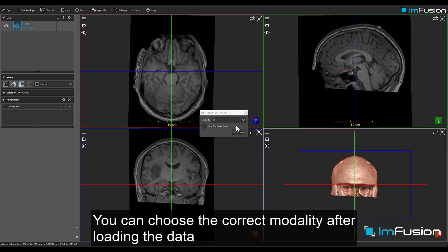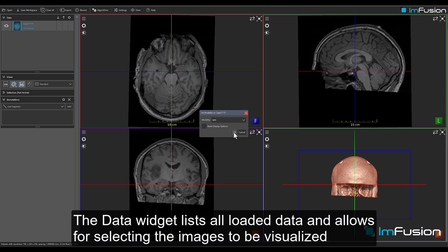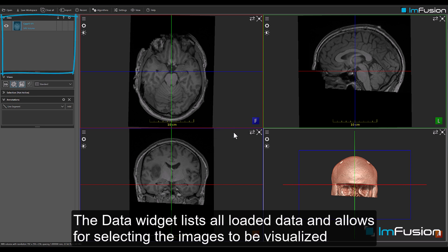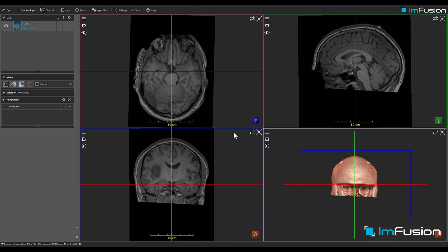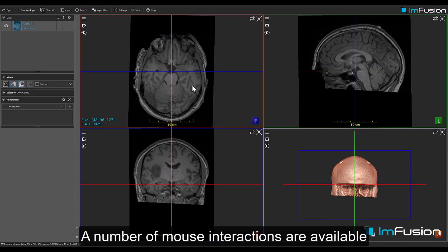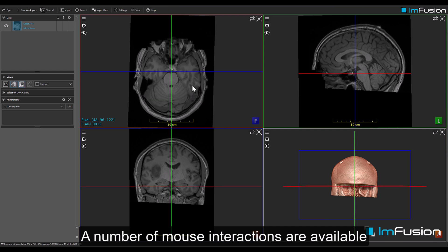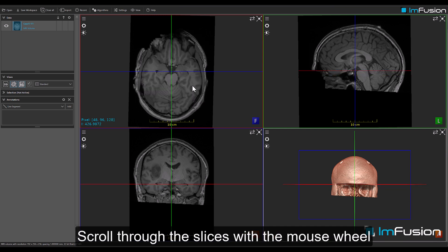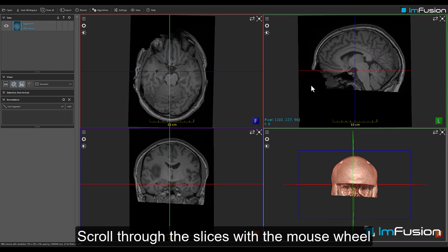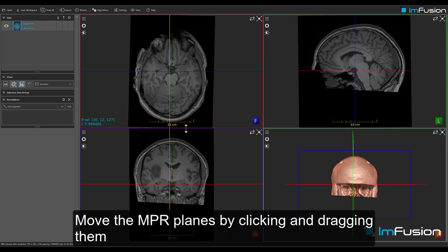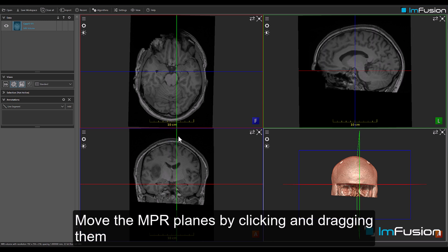You can choose the correct modality after loading the data. The data widget lists all loaded data and allows for selecting the images to be visualized. A number of mouse interactions are available: scroll through the slices with the mouse wheel, and move the MPR planes by clicking and dragging them.